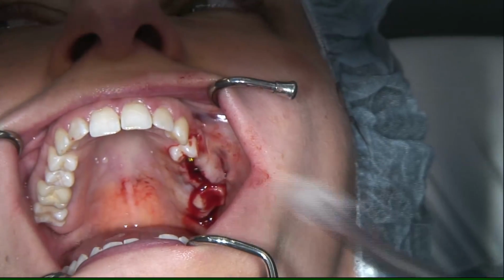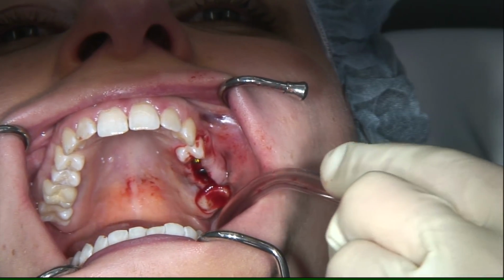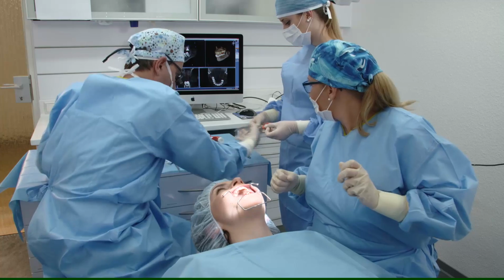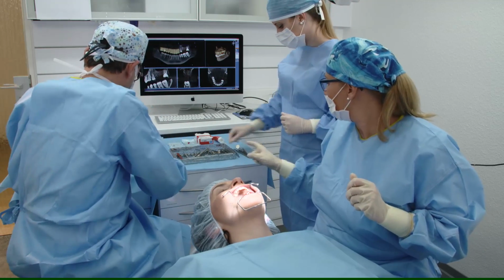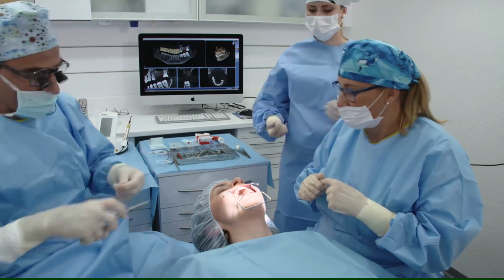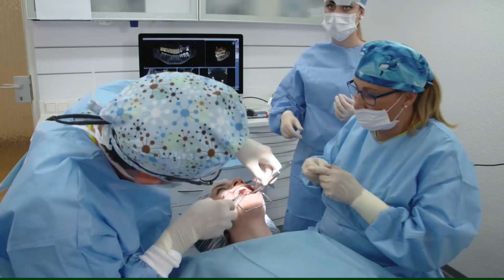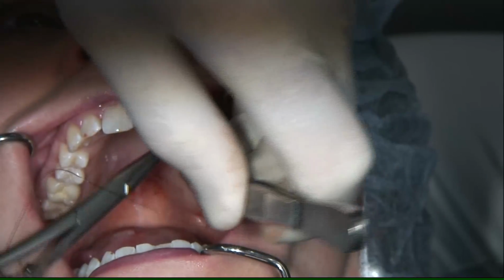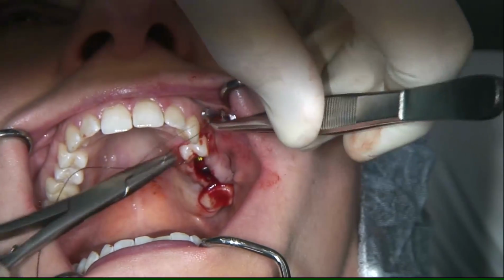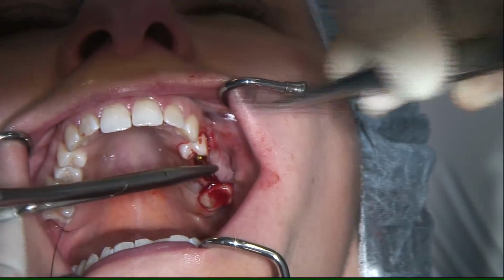So though we have prepared the abutments on tie base, we can use them later, but we will go the secure way, the safe way, by doing a submerged healing. That means the cover screws are fixed on the implants and we will suture the flap.